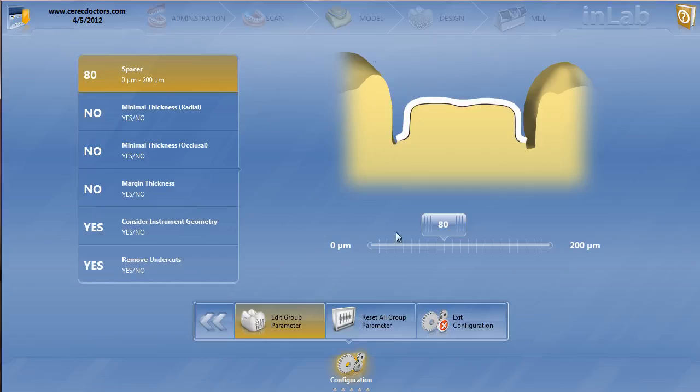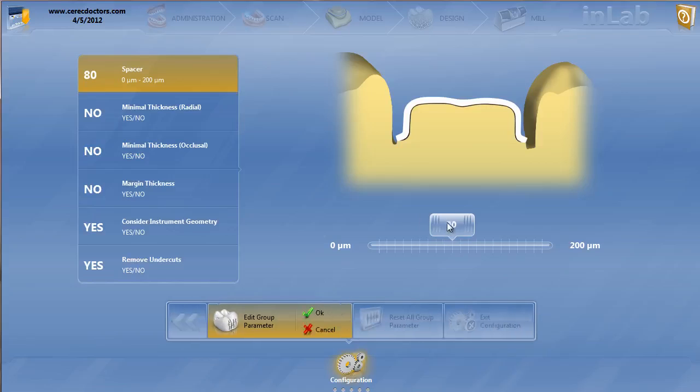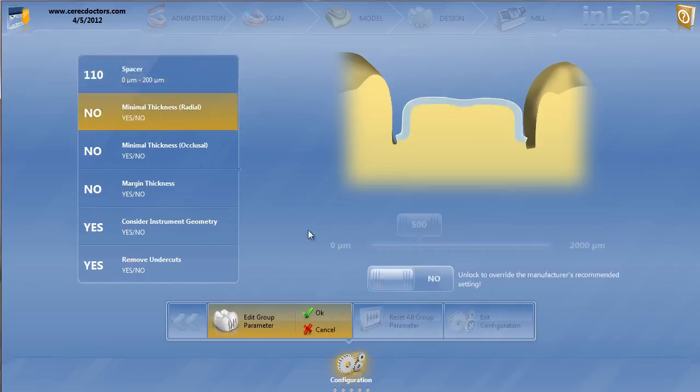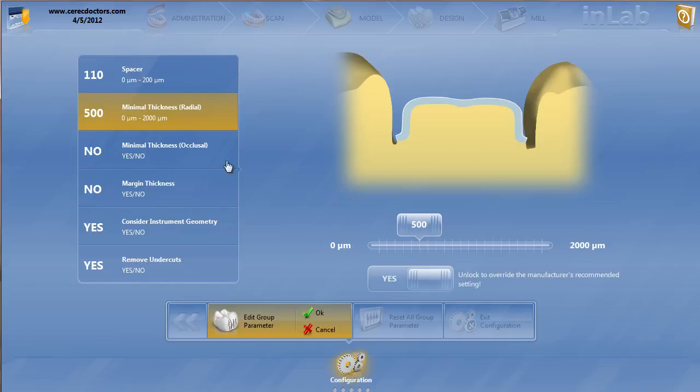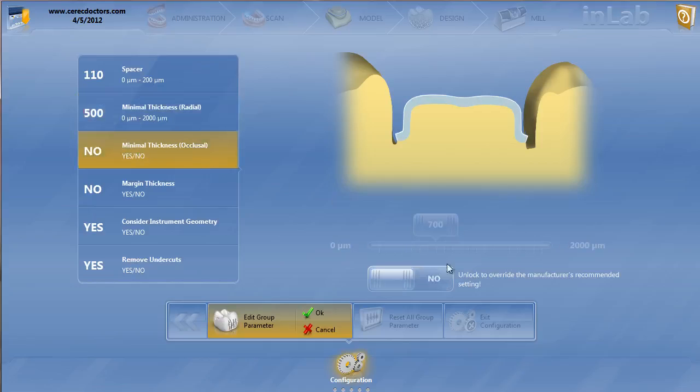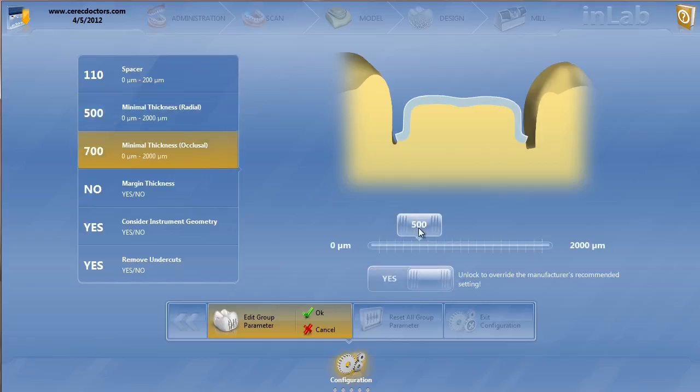For spacer, since normally I'm using Emax and bonding, I'm still going to keep the spacer somewhere up there like I normally would. The minimal thicknesses work the same. The minimal thickness radial set at 500 is good. The occlusal, typically I put this at 500 as well, just to have a nice half a millimeter coping around the tooth.